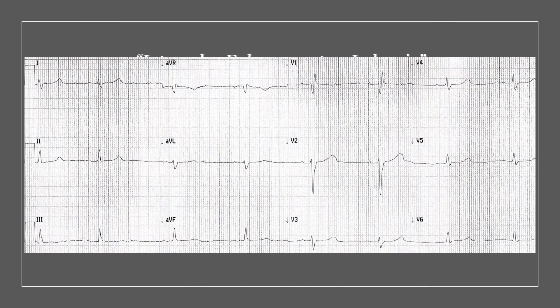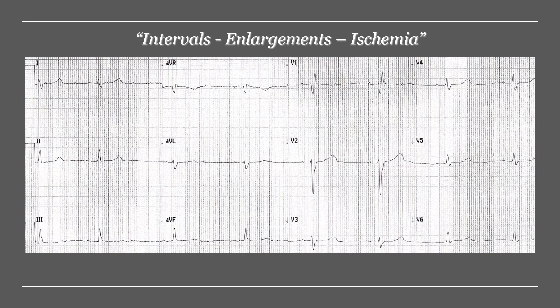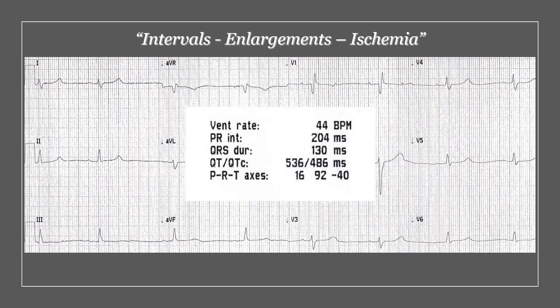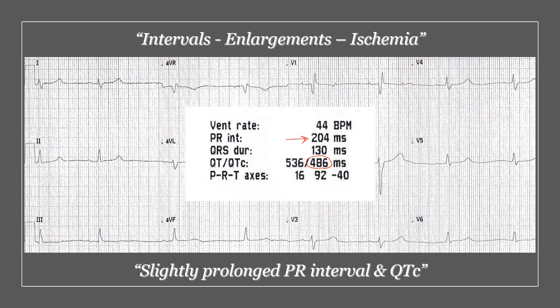Moving on to the intervals: the PR interval is 204 milliseconds, so we have a prolonged PR interval — more than 200. The corrected QTc is 486, so it is slightly prolonged as well. From the enlargement point of view, there is not really much to say on this ECG. And from the ischemia point of view, there is no significant ST elevation, depression, or T wave changes. In summary so far, we have a prolonged PR interval and QTc in addition to what we had before.